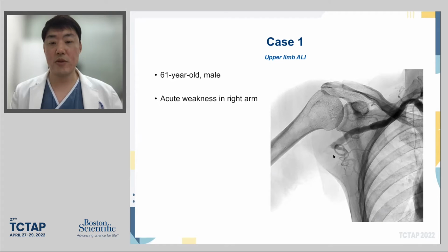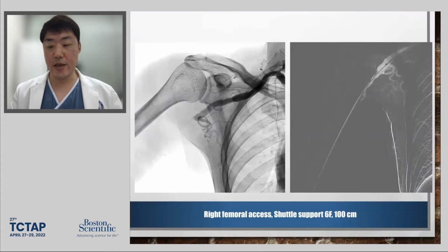So you can see one in the proximal brachial artery. We went in with the normal wire, and the guide wire passed through very easily, which suggests this is acute thrombus. With the conventional techniques, for example aspiration catheters, most are 100 centimeters in length, and all the devices that we have, when we come from the femoral access, are very short to treat thrombus in the arms.